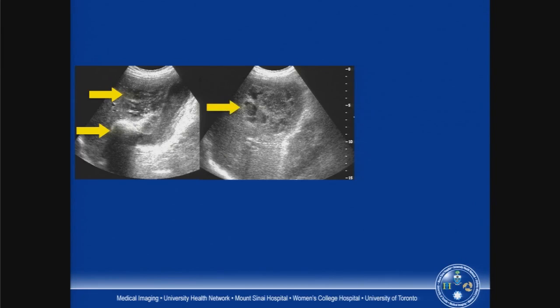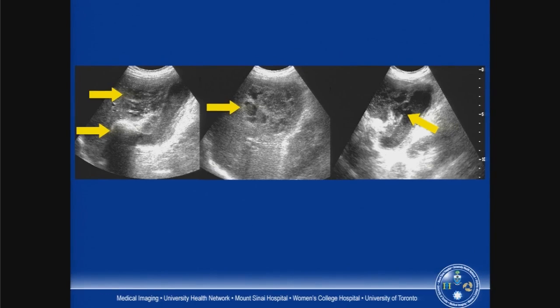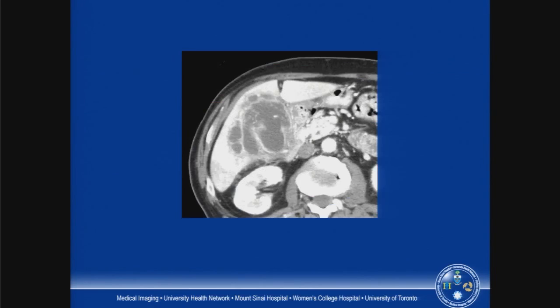And then we return and look more carefully at the gallbladder, and we can actually see the point of perforation in grayscale. Note that this gallbladder isn't distended, and that's because it's perforated and decompressed itself, so this distensibility rule doesn't work well once the gallbladder has perforated.